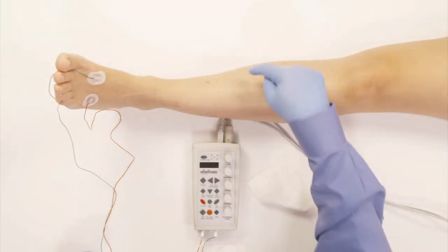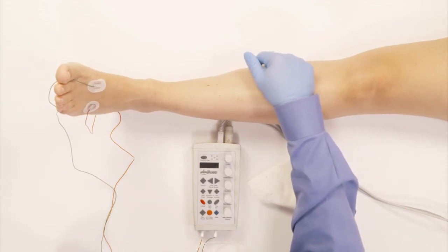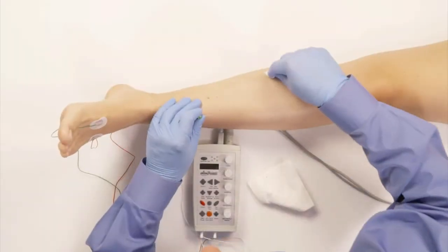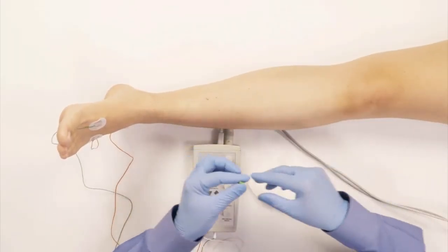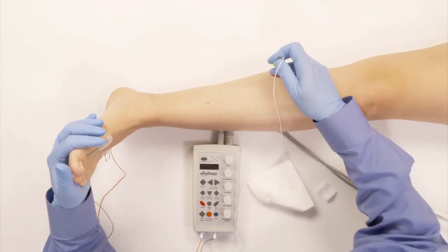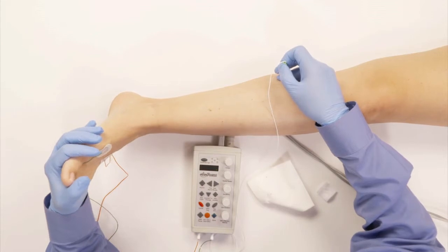Now this is the medial gastrocnemius muscle, which is on the inside of the leg, as you can see in this picture. I will place the needle electrode right here. It's easier to say to the patient, 'Push down against my hand as though you're pressing on a gas pedal—this way the muscle will contract. Now relax.'